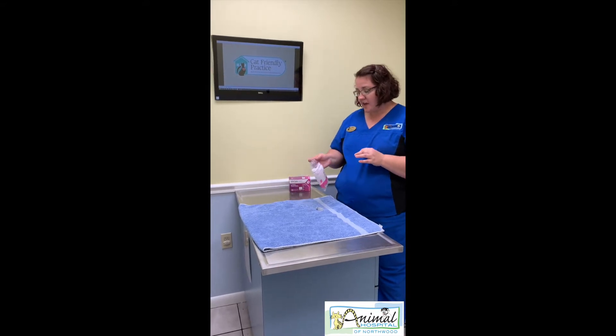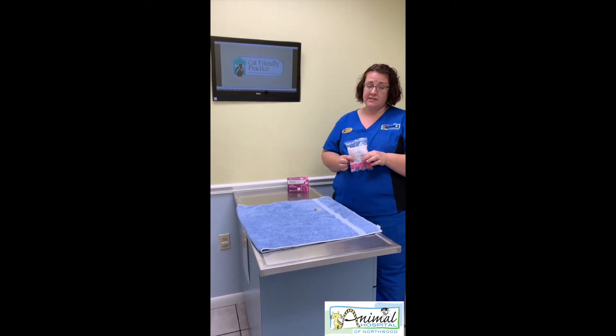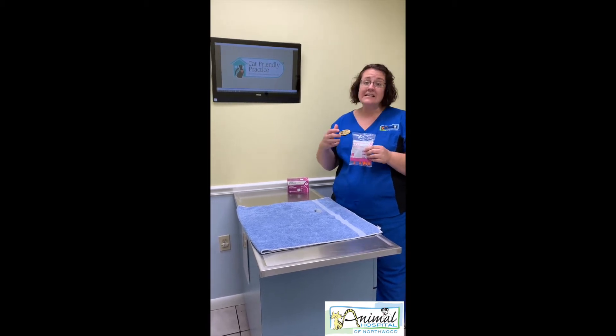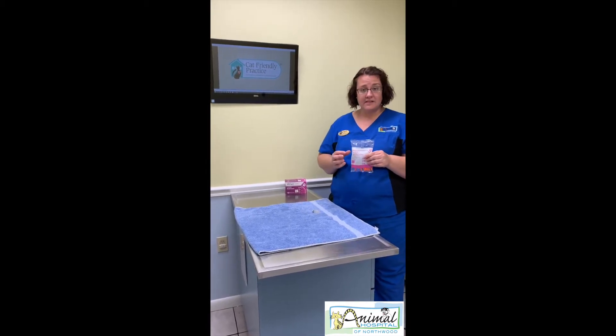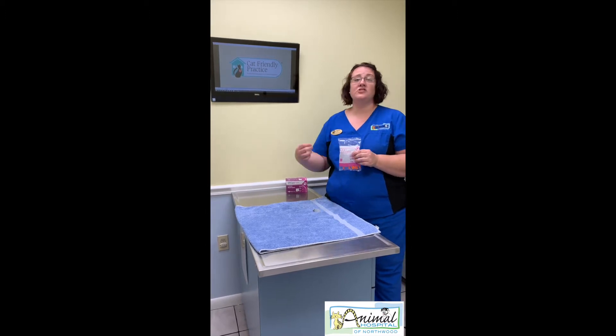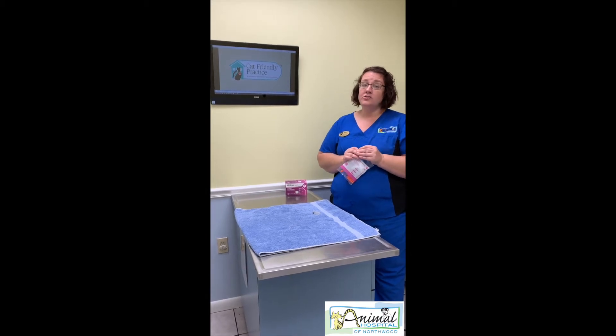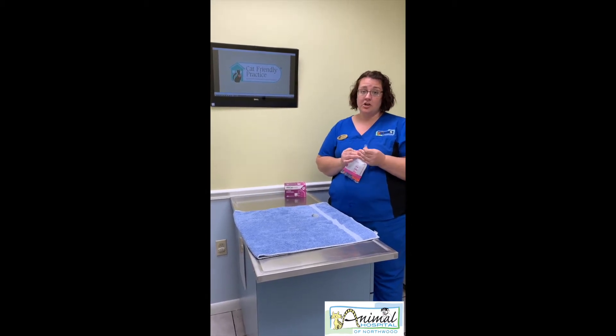You want to make sure you have the appropriate syringes for your insulin. Your veterinarian should have prescribed you the appropriate size and type, because there are different types of insulin and different types of syringes to go with them. We want to make sure they match, because if not you're getting the wrong dose, and that can be catastrophic to your pet.